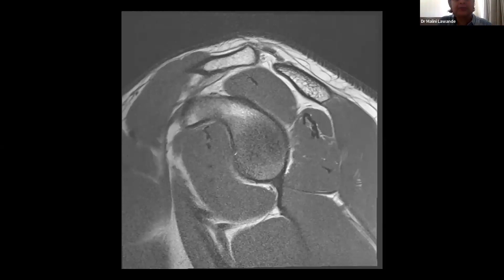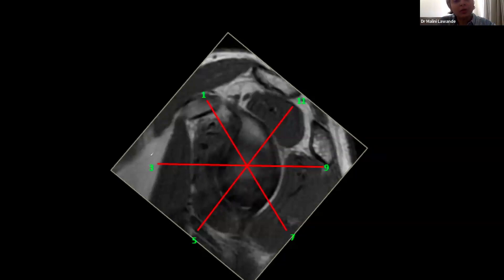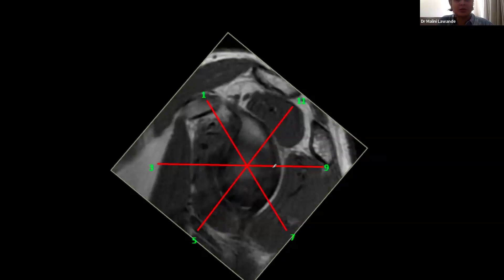When describing labral tears, there is the clock method, but the problem is that nine o'clock and three o'clock are opposite in each shoulder. Some people call three o'clock the anterior labrum regardless of which shoulder, while others use nine o'clock for anterior and three o'clock for posterior, which leads to confusion.